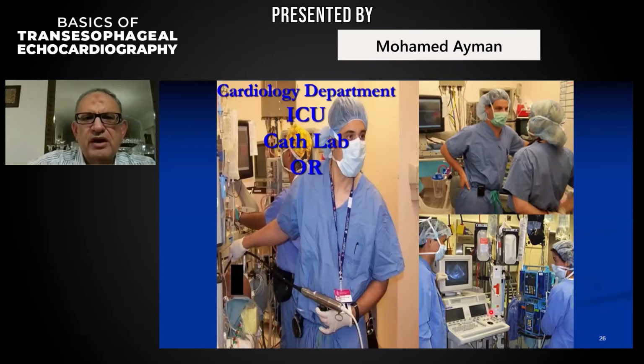So, what are the indications of transesophageal echo? Actually, TEE is very valuable in examining patients in the cardiology department, in the ICU, in the cath lab, and in the operation room.